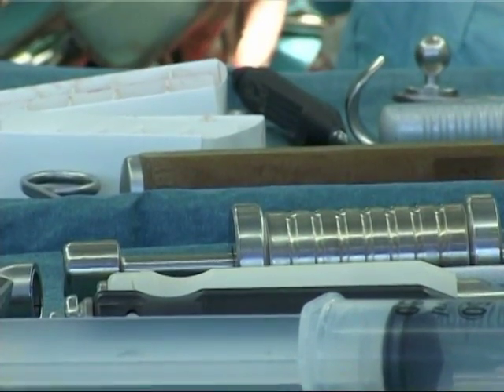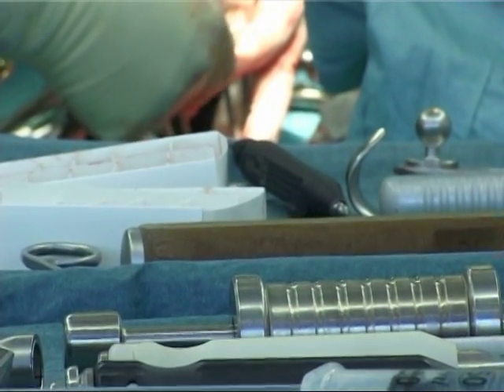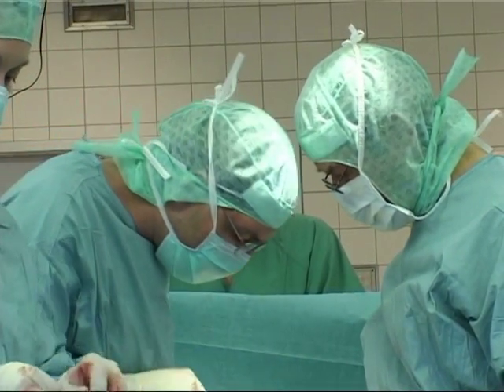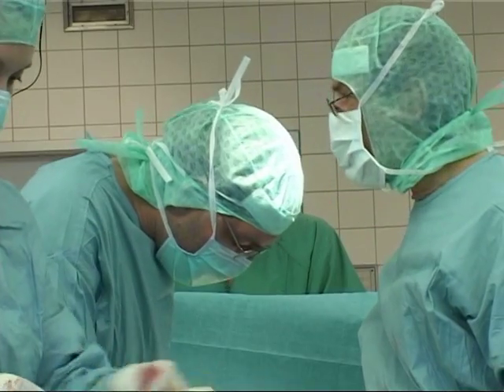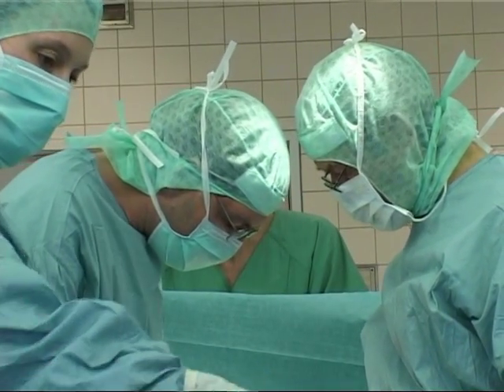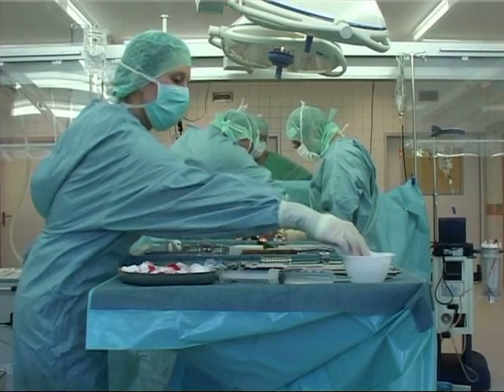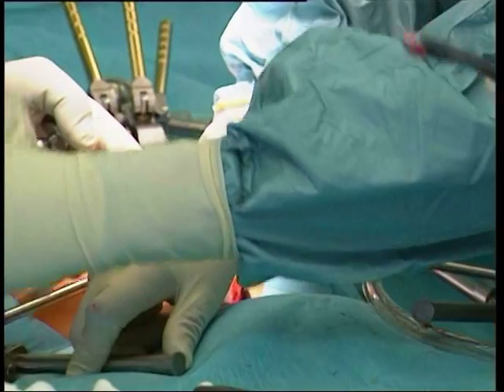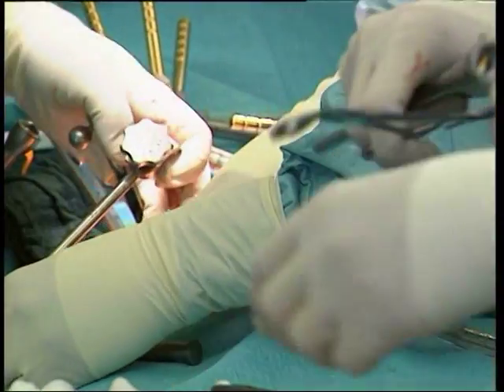We then insert small hooks between the fifth vertebra of the lumbar spine and the sacral bone. This is all done approaching from the front. We can then clear out the disc space in between. We take out all the soft disc tissue so that the bare bone is in front of us. Next, we drill a small channel into the bone.